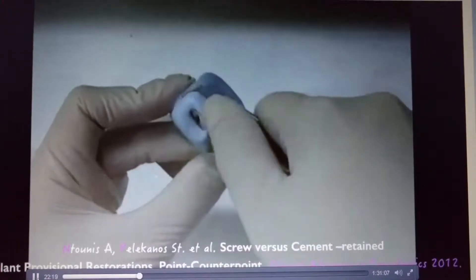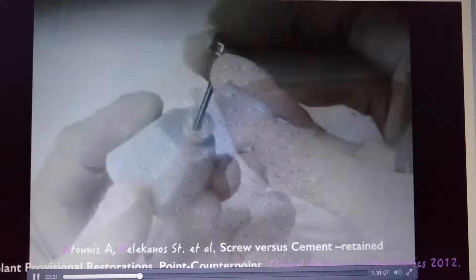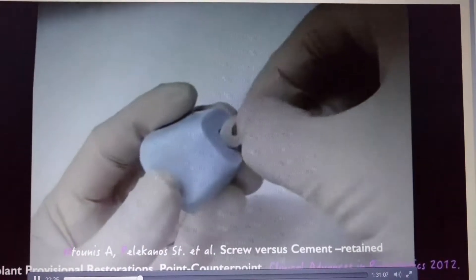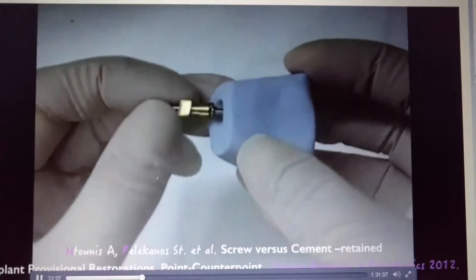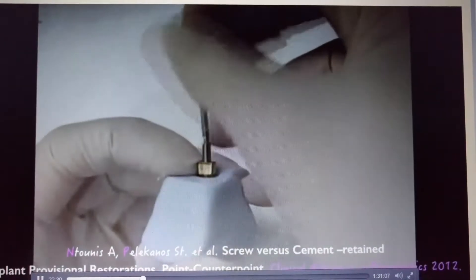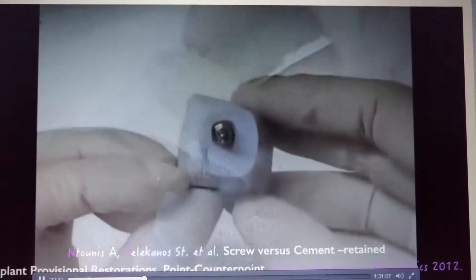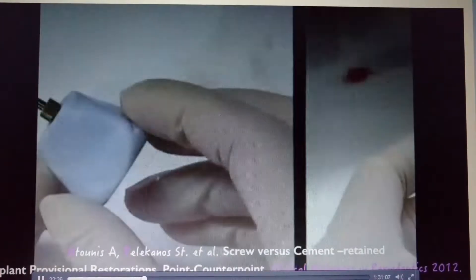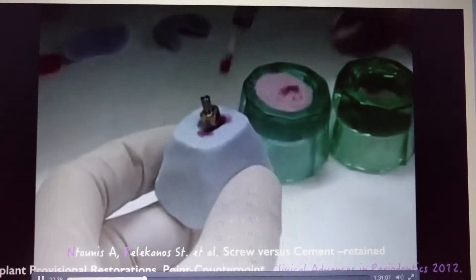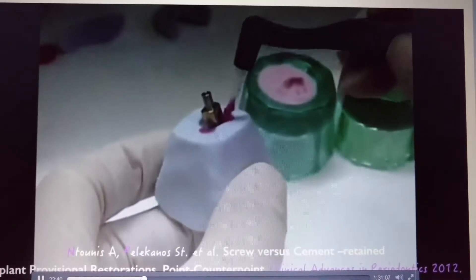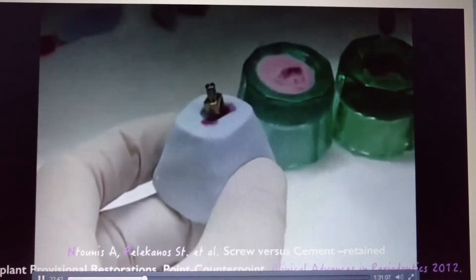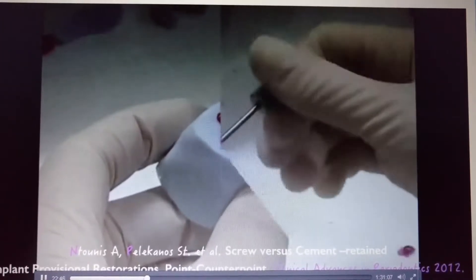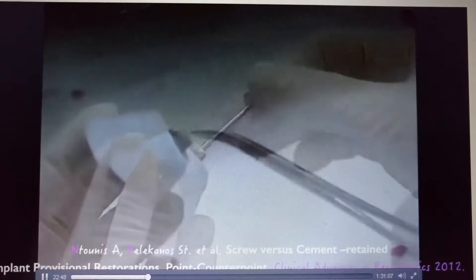What you have created that way is basically an impression of the emergence profile. All you have to do is connect your prefabricated impression copy that the company is giving you on the replica, after you remove the temporary provisional restoration, and fill the rest of the space with either flowable composite resin or pattern resin. Now you have a customized impression copy for that site that copies exactly the emergence profile of the provision.